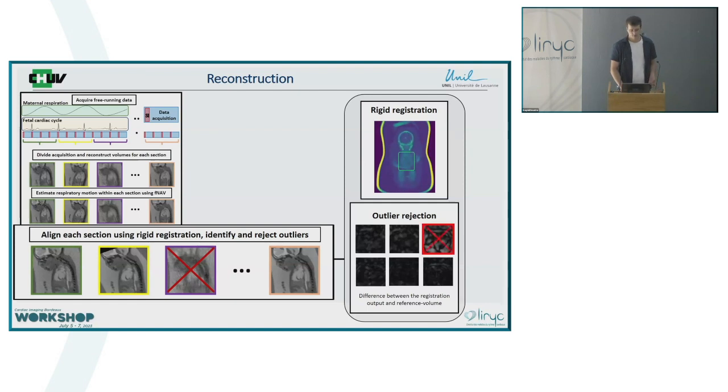So in our example for fetal heart MRI, we are choosing a region of interest around the upper body of the fetus. From all of the real-time frames, the frame with the highest mutual information within this chosen region of interest is taken as a reference frame to which all the other frames are then registered.